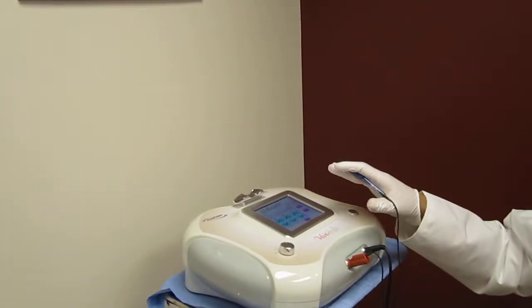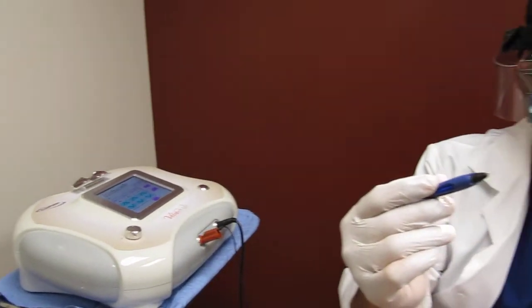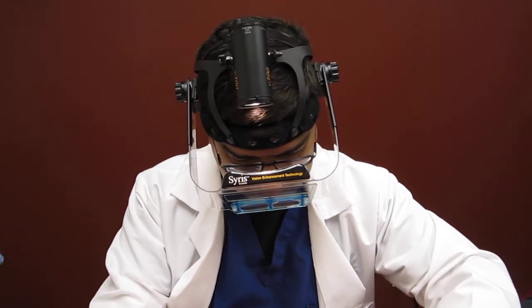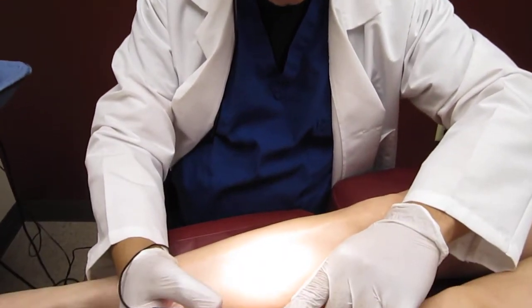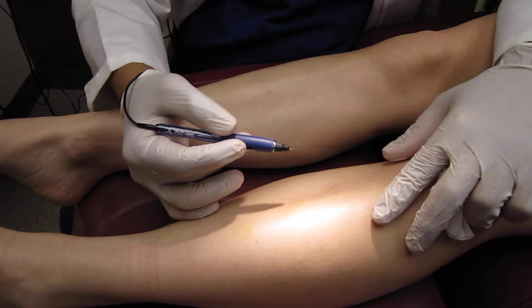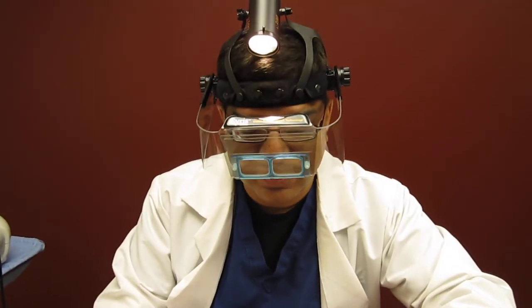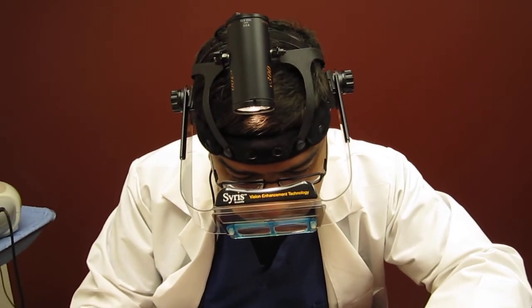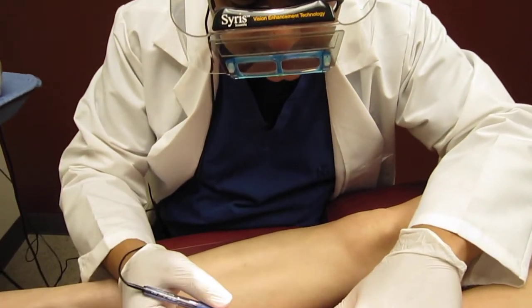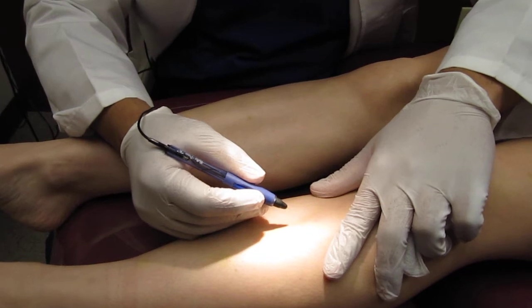We've already powered it on and connected it to the handpiece. It uses a very tiny small needle, which you can see against the surface over here. It's hair thin and does not require any local anesthetic. Some patients who are highly sensitive, we sometimes use the EMLA cream for local anesthesia on the surface prior to treatment. In this patient we're not using any EMLA cream, and we're going to treat the leg spider veins using the lowest wattage, which is at level 20.